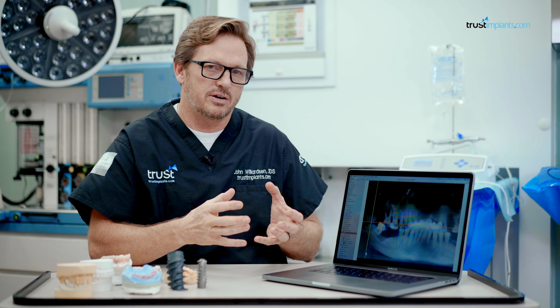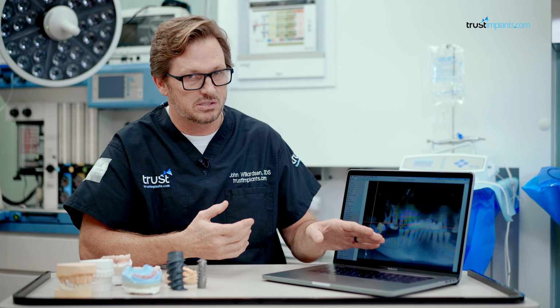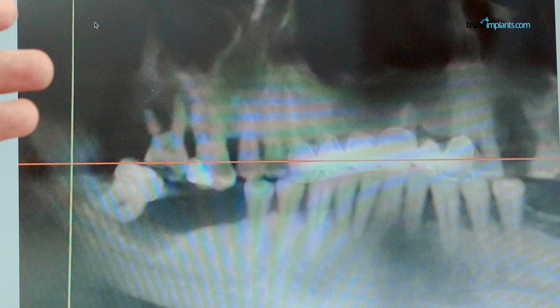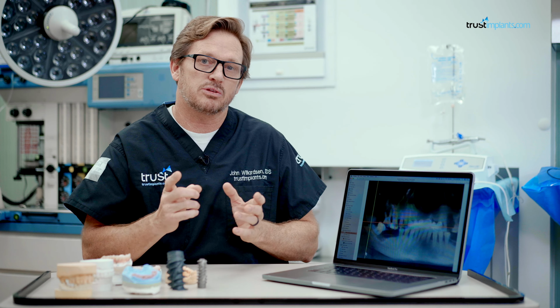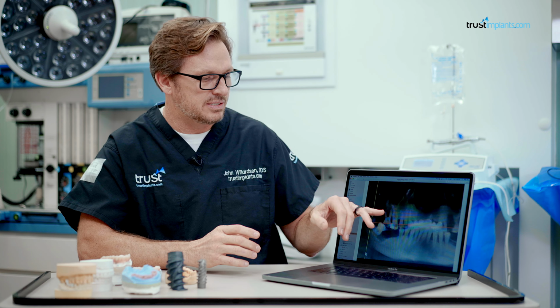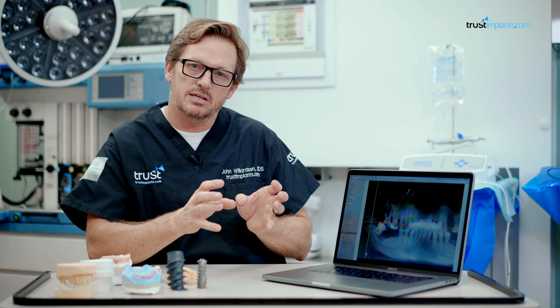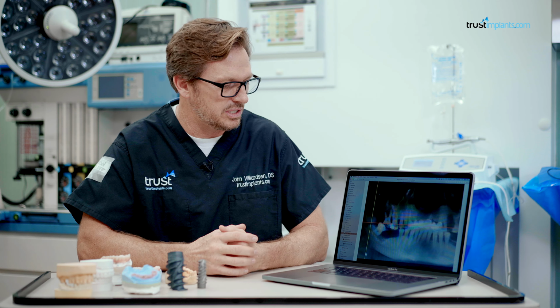So there are a lot of variables, and then the number of implants that we're going to place, which would be six on the bottom, six on the top. We've lost all of the bone around the molars on the upper back jaw, and that's where the maxillary sinus is. So in his case, once these teeth come out, we have to build that bone up in the sinus in order to provide him with an ideal aesthetic and functional long-term situation.